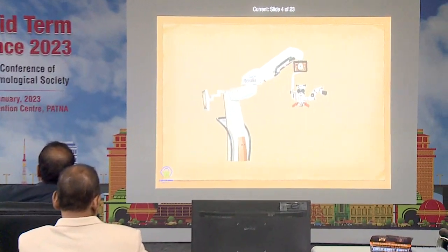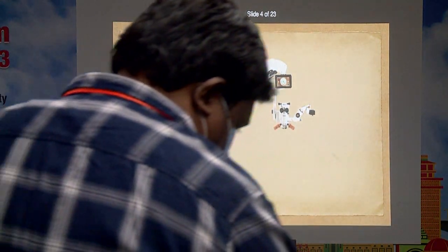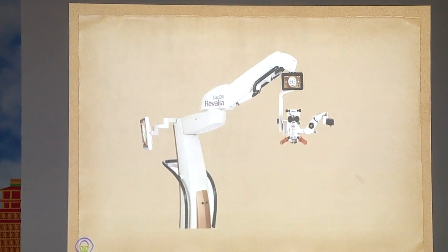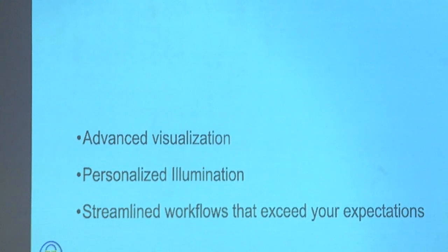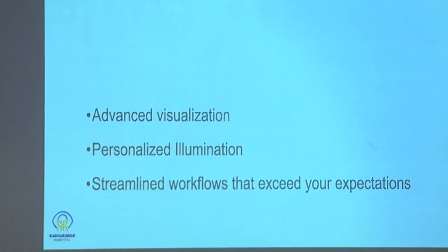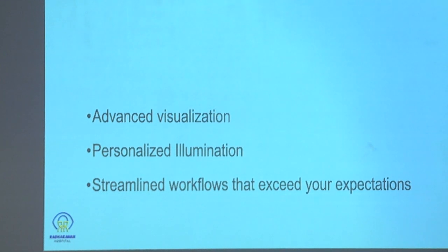There are minimal adjustments or customizations that you can make from the minor screen which is right on top of the surgeon's head, and then the major customizations or setting changes have to be done from the screen that is behind it. So that's fully loaded. This one's not fully loaded though, but it does the job all the same. The visualization, of course, is very advanced. The optics doesn't have a brand name to boast, but the optics are beautiful.